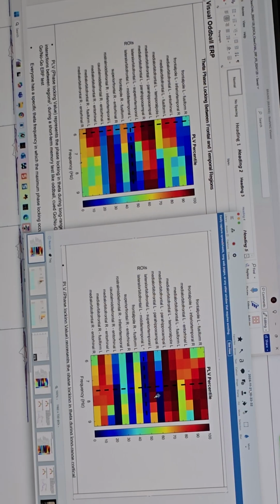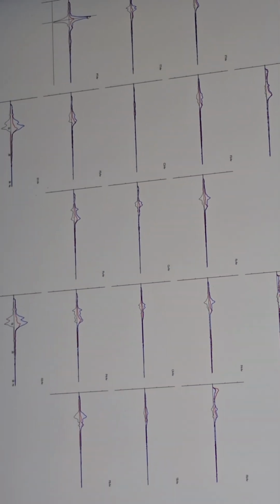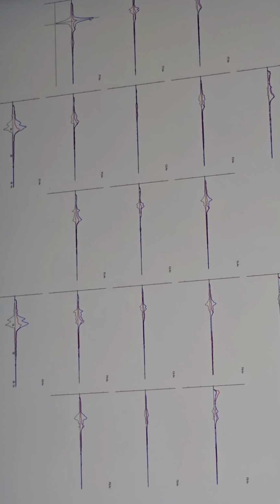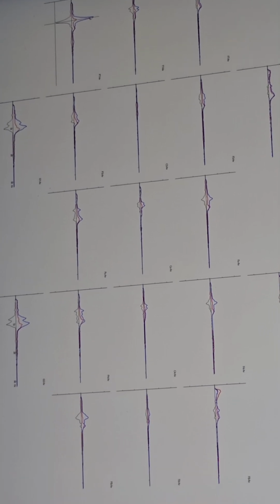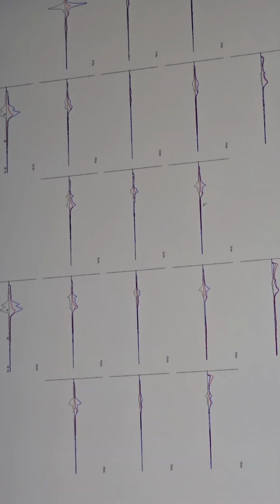We were training in the 7.5 hertz range, and this is about 8 hertz. So I think that's what we're affecting here. So I'd be inclined to continue the same thing. Yeah, we should. We're seeing some really big changes.